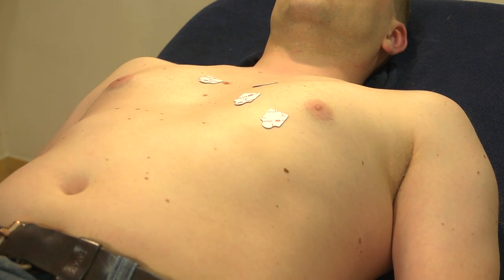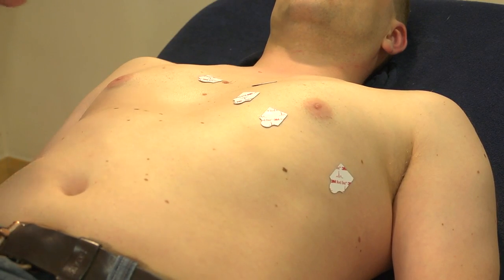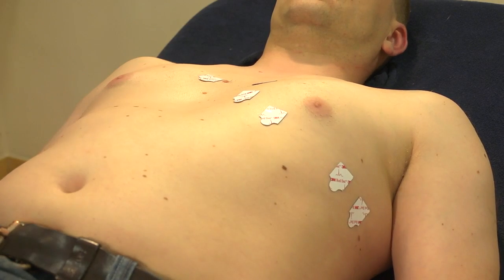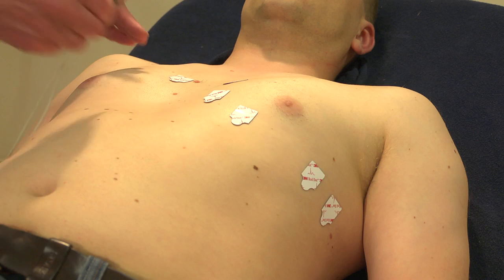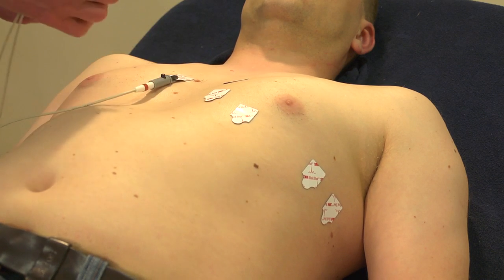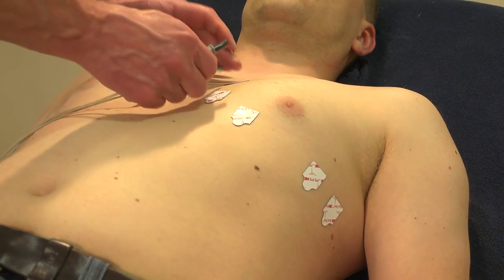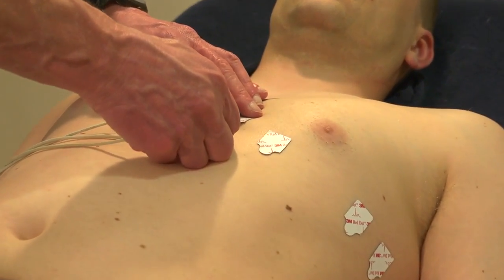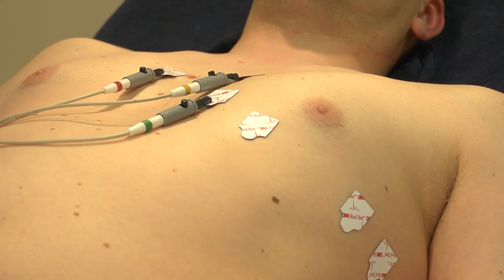C5 goes on the anterior axillary line, and C6 goes in the mid-axillary line. Now that I've placed his electrodes, I need to get the ECG device and attach it. I'm attaching the chest leads first — C1, C2, C3. They're very easy to attach; I've got it written down here where they should go, which is handy. C4, C5, and C6 are here nearby and I can just read them off the lead label.